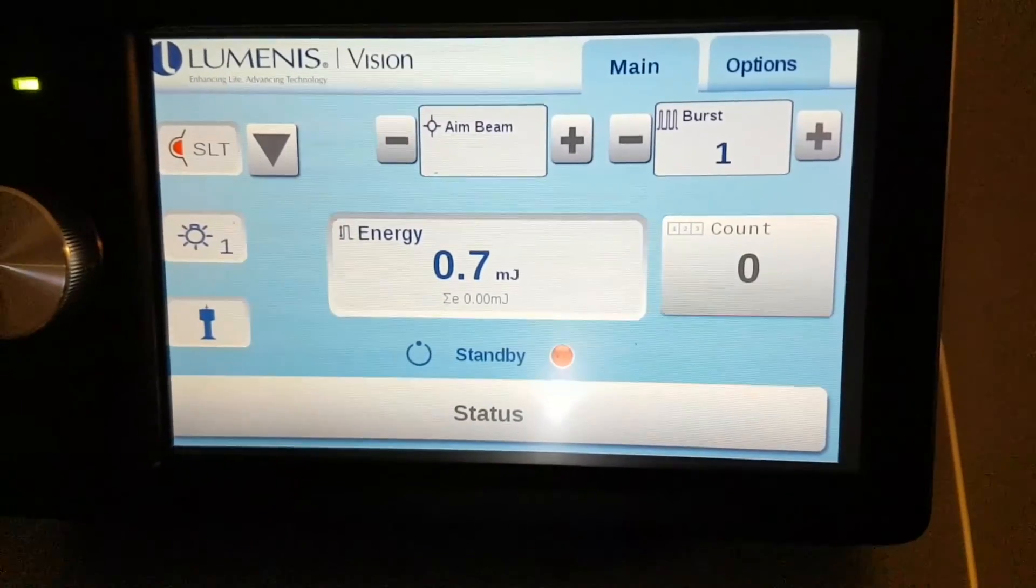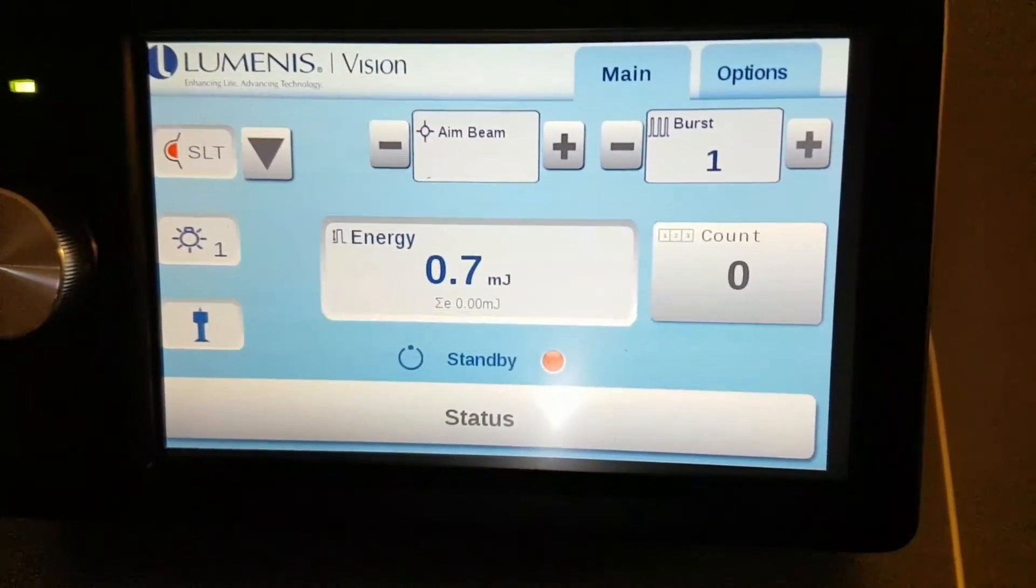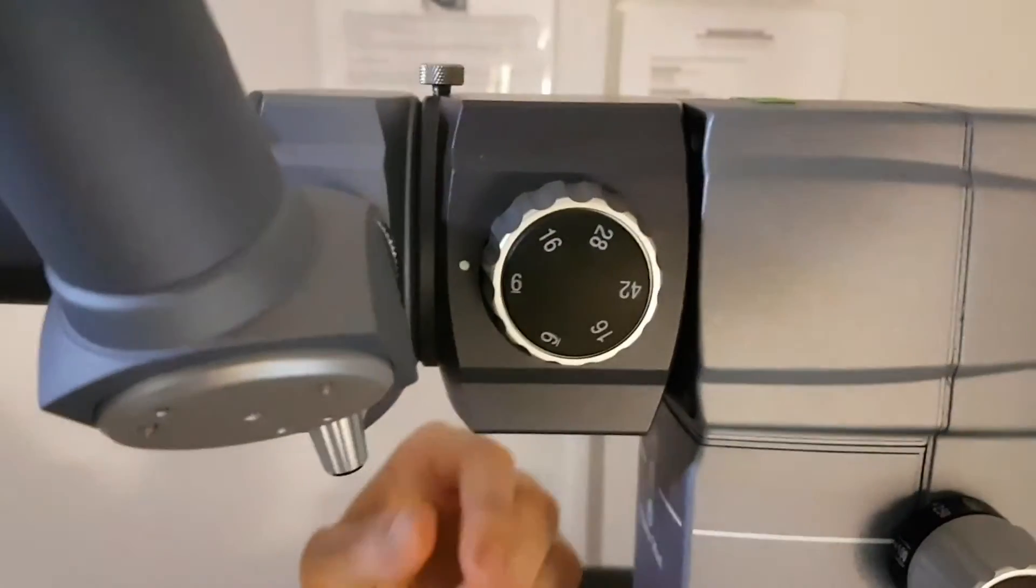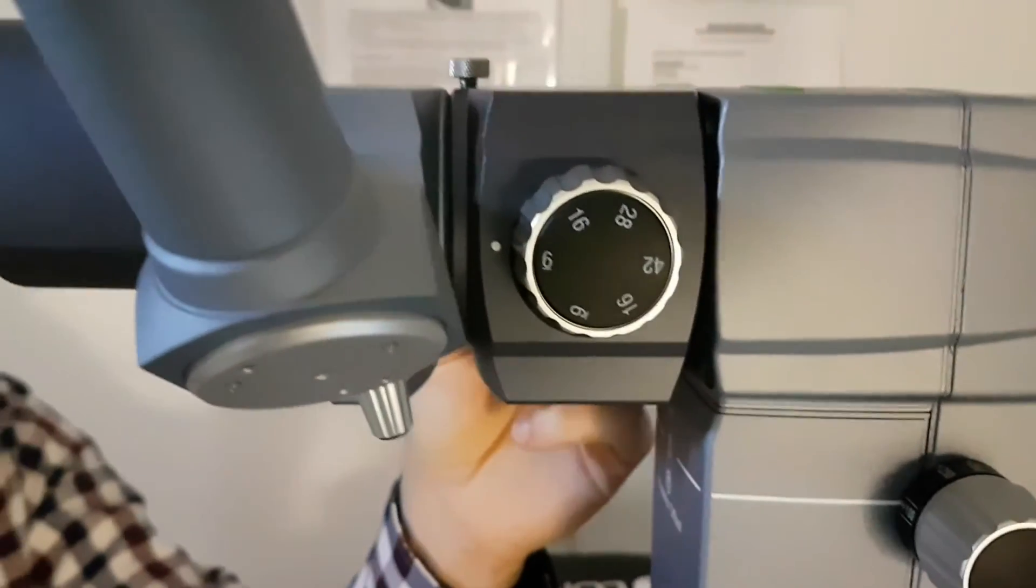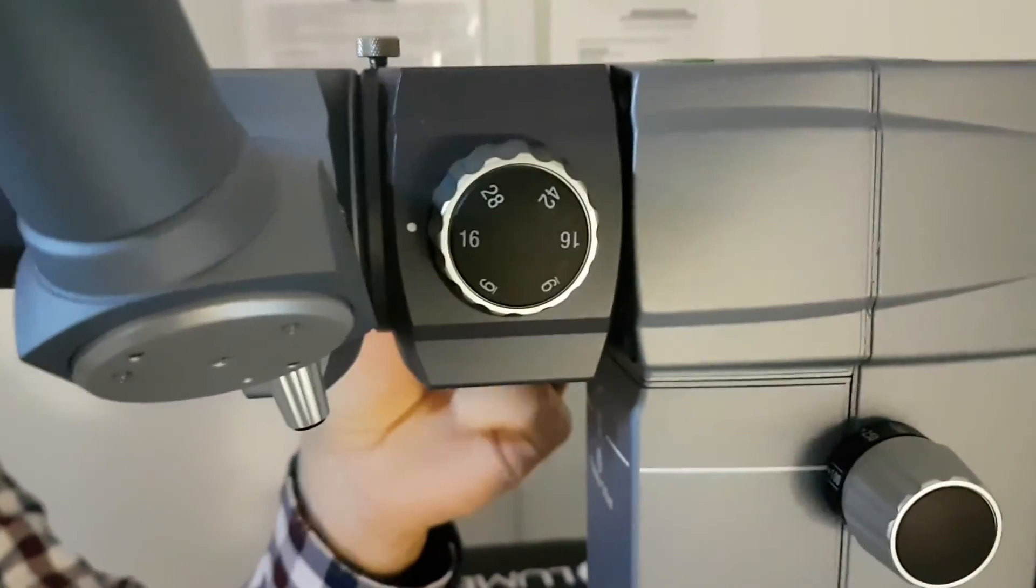For the rest of the laser, the magnification, you should be pretty familiar with that. You have 6, 16, 28, 42.